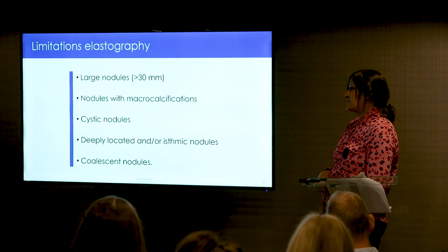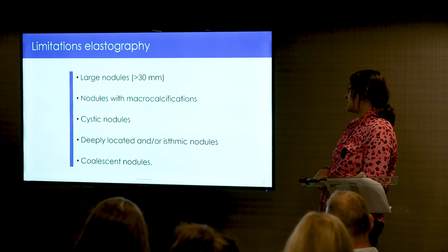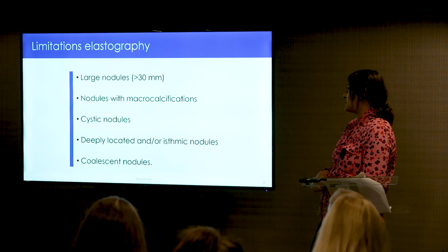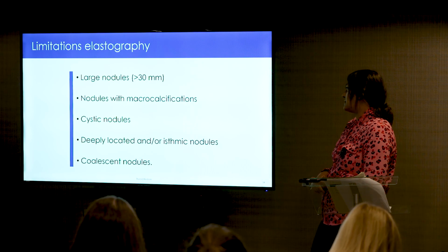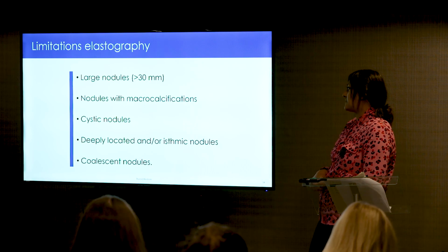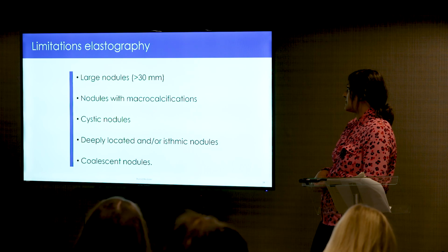For example, large nodules greater than 3 centimeters, and the presence of macrocalcification in any nodule can also limit the interpretation. Any pure cystic nodule, any coalescent nodule, and any nodule in a deep location. So already you can see there are multiple limitations to elastography.